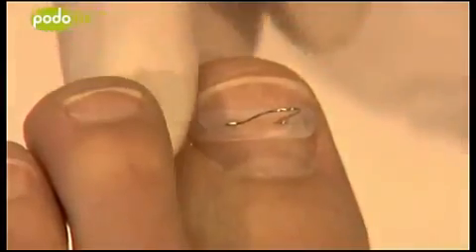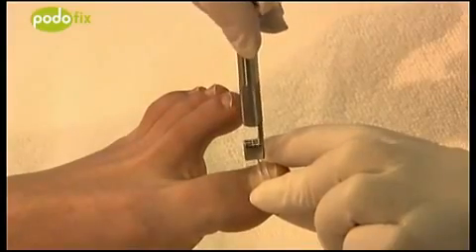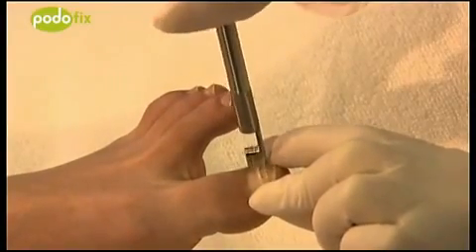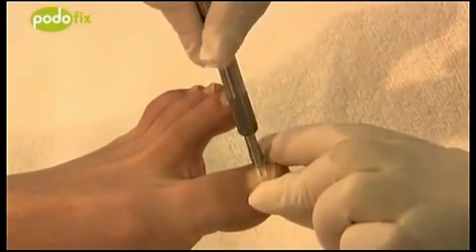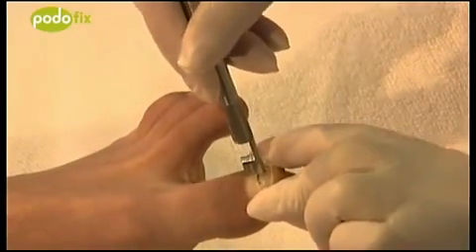Place the tension instrument into the wire loop. Turn at least once and a maximum of 2 complete turns until the desired tension is attained. You can determine the force required by asking the patient. Then press the tension instrument lightly down in order to push the wire into the recess.